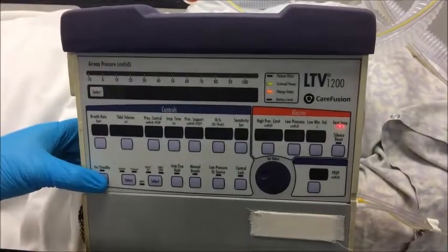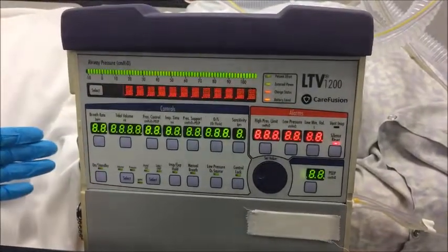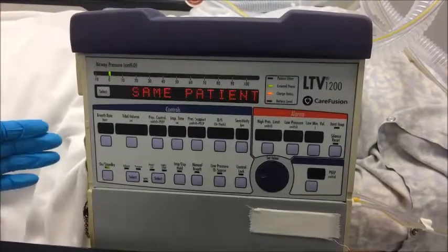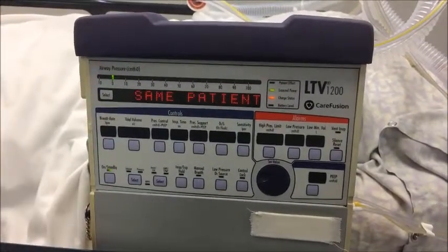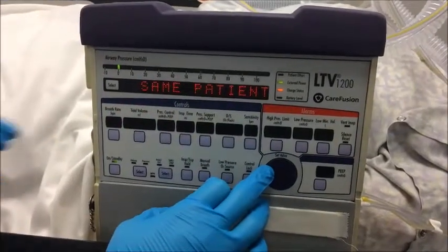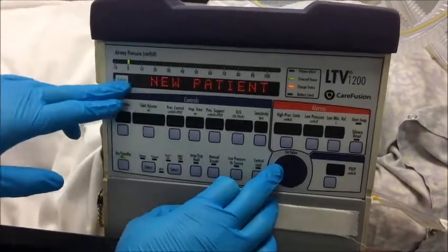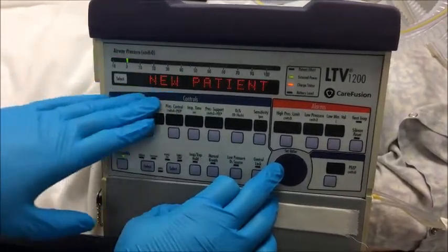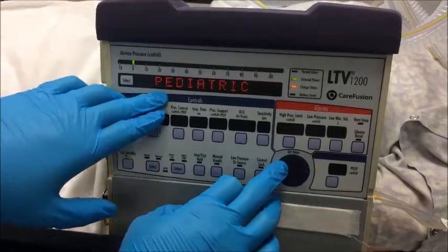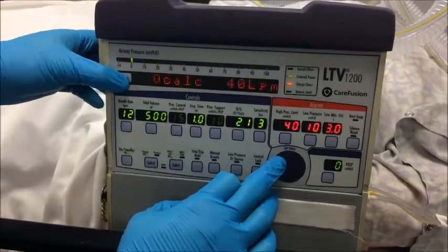The next thing we're going to do is turn your ventilator on. Make sure your mechanical ventilator is connected to oxygen. Some ventilators require air and oxygen, others just oxygen and have an internal air compressor. In this particular model, we're going to select new patient. We don't know what the settings were prior, so we're always going to start with new patient. We're going to hit select and then go to the patient size that we have. In this case, it's an adult, so we will select that.